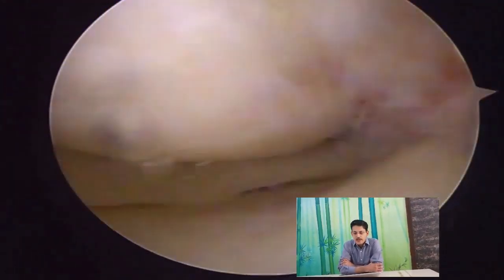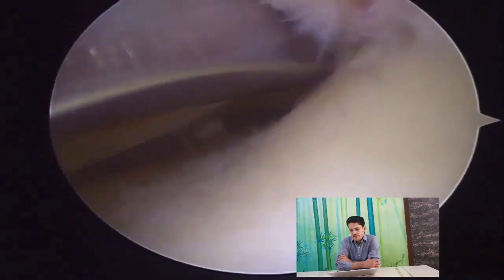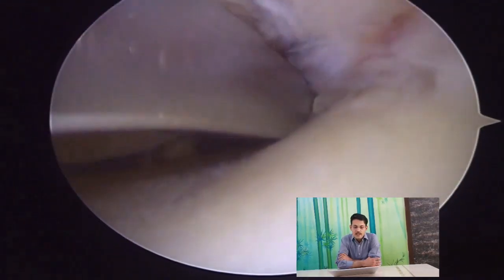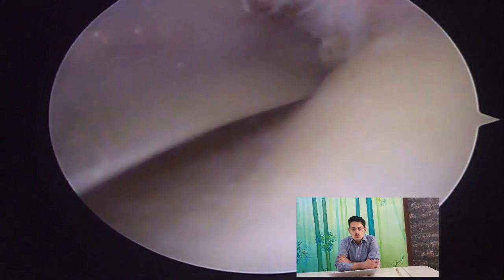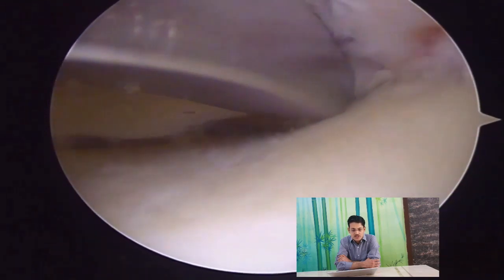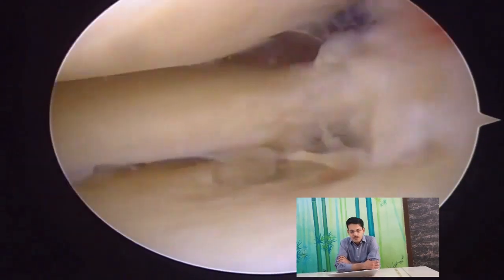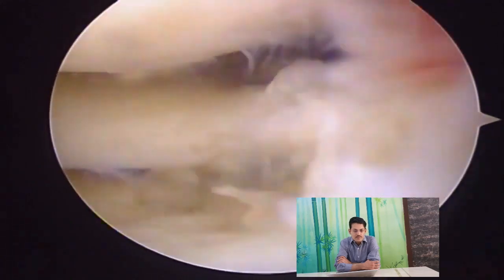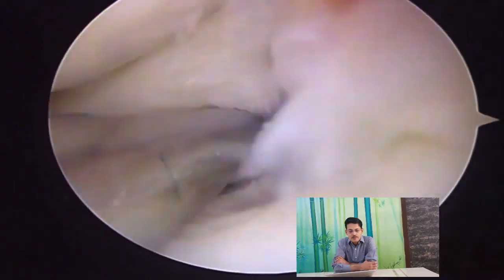The patient would land up needing a total knee replacement in one or two years if left untreated. In this case we plan to do a root repair. We can also see cartilage loss here. A special meniscal root repair jig, which comes in right and left sides, is used. We drill with this specific jig, confirm it is exiting at the point of root insertion, and once confident the position is good, we proceed to the next step.